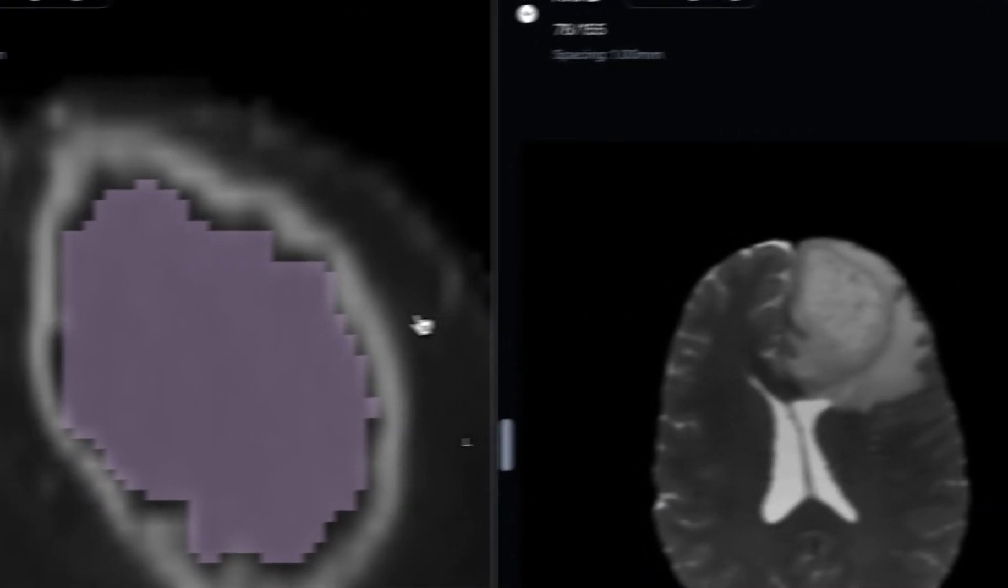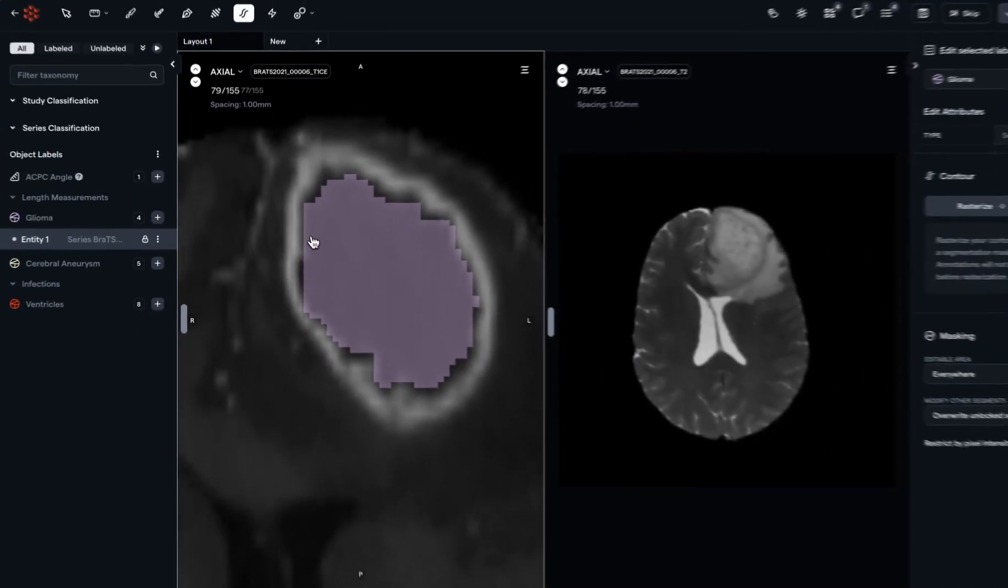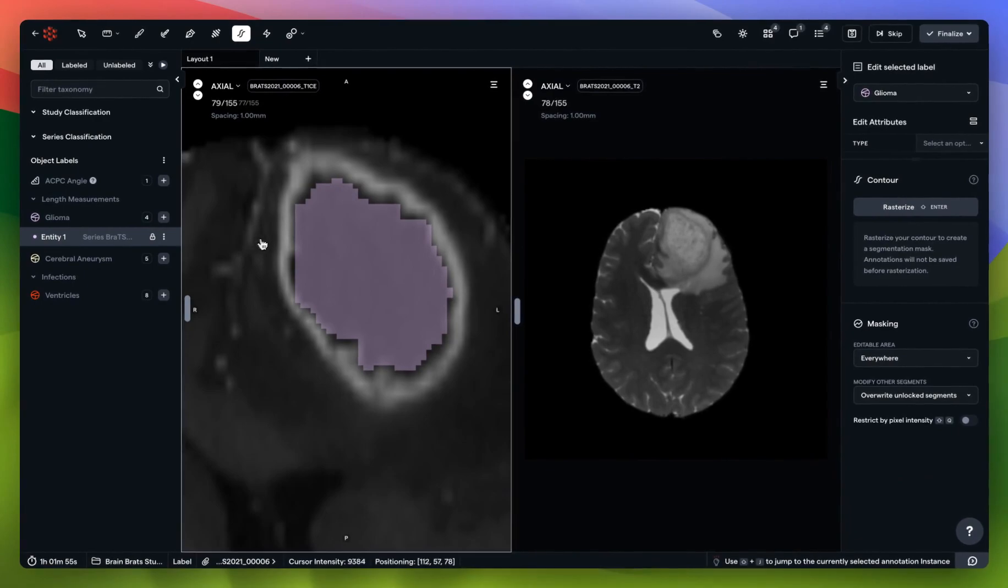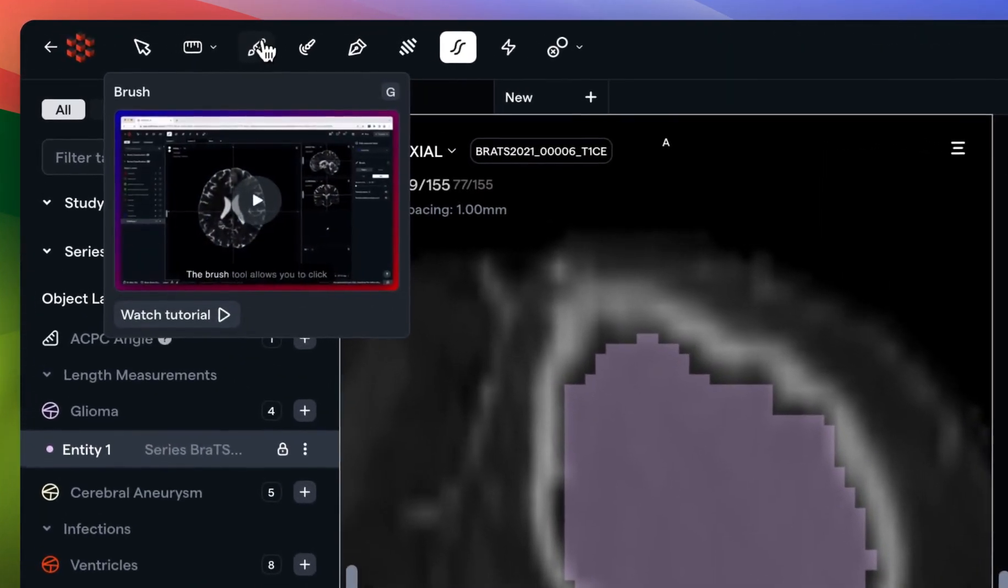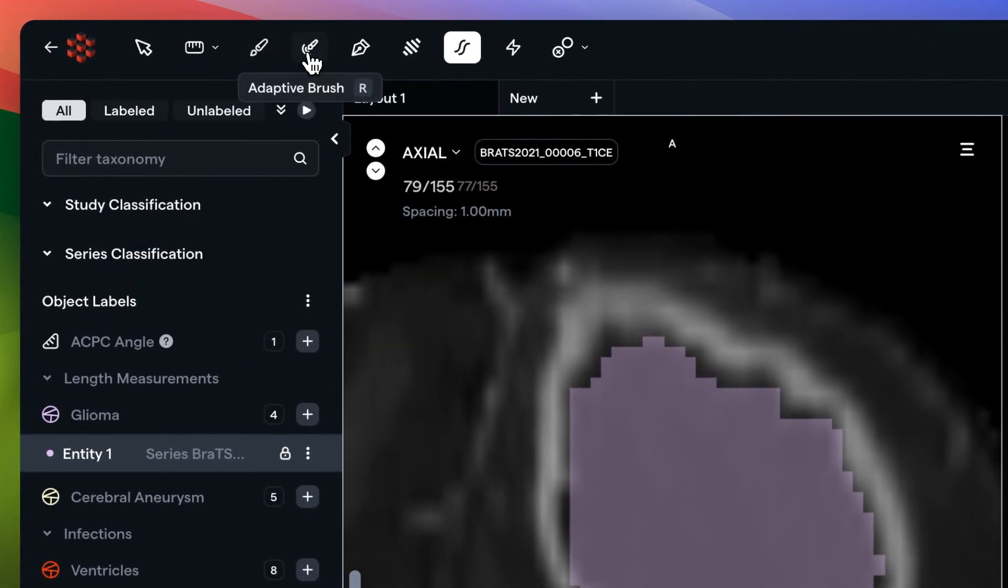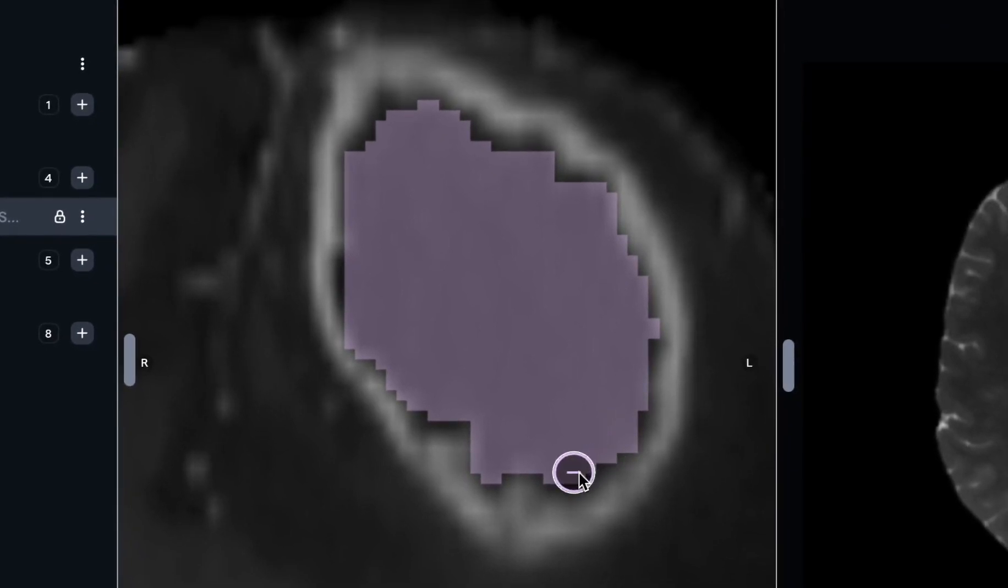There might be some places where you're seeing a little bit of extra black, and it's very easy to come in using either the brush, perhaps the adaptive brush, or the pen tool and do just a very light touch-up. Left click to paint, right click to erase.